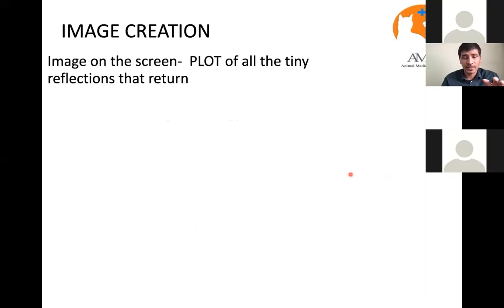So here, that's how it is made. If you remember the big hoarding board, if you are traveling on the street in the evening, you will see a big hoarding board with an image, but that image is a combination of multiple tiny dots that gives the big image. So every dot is responsible for creating the image. Some specific kinds of hoarding boards use small dots of different colors to create the image.